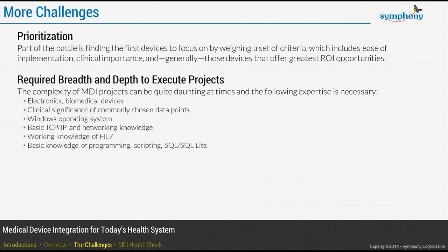Okay. All right, so on to a few more challenges. Prioritization. This is the big one. I actually touched on this a little bit, discussing the meaningful use requirements. So, what devices do we implement? And again, it's how much time do you have, and what devices do you feel are going to benefit you the most? What gets you the biggest return on investment? That's what you're looking for.